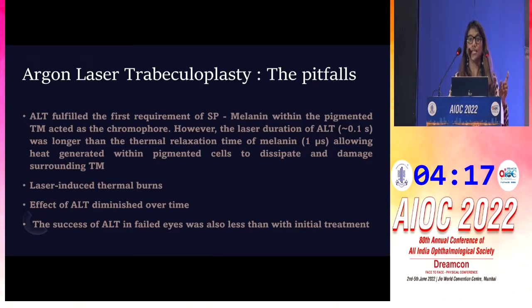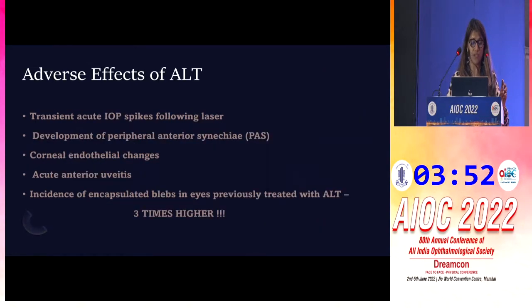However, the pulse time of the argon laser was 0.1 second, which was much longer than the thermal relaxation time of the melanin pigment, which is 1 microsecond. And this was the problem which led to laser-induced burns, the formation of peripheral anterior synechia, and it did not show success in ALT when the procedure was repeated.